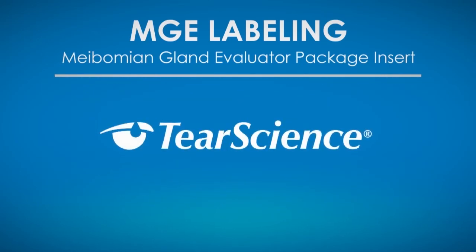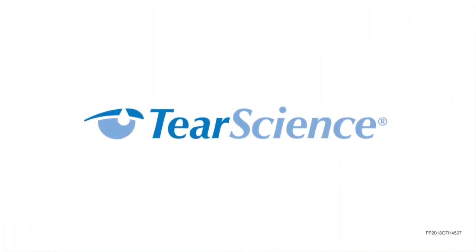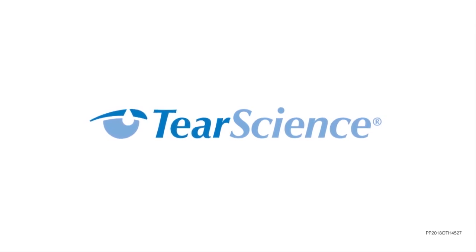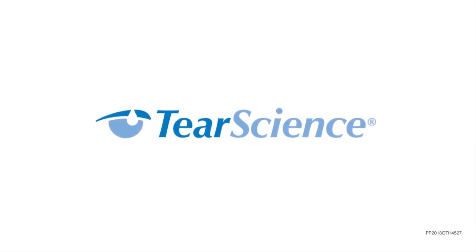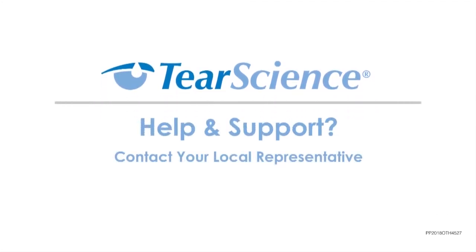If you have any questions, please contact your local representative. This information will help you to begin using the Meibomian Gland Evaluator. As always, we are here to help. If you have questions or need assistance, please contact your local representative.